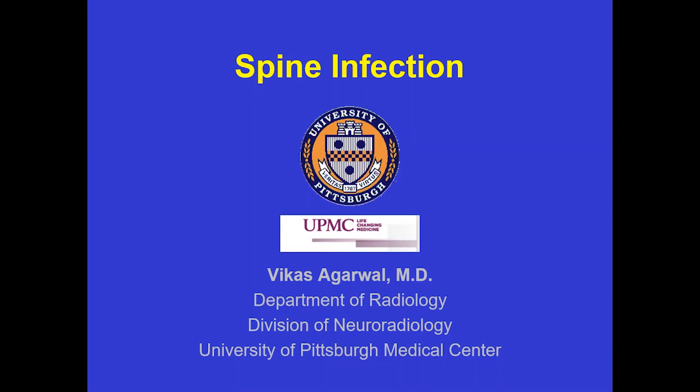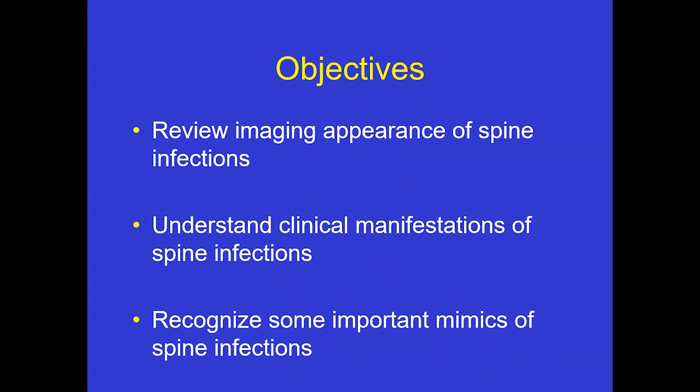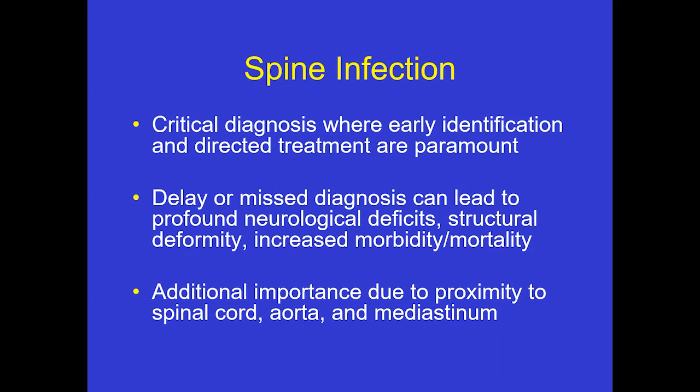I'm a neuroradiologist at the University of Pittsburgh Medical Center in Pittsburgh, Pennsylvania, and today I'll be talking to you about spine infections. Our objectives are to review the imaging appearance of spine infections, to understand some of the clinical manifestations that go along with spine infections, and then also recognize some important mimics of spine infections.